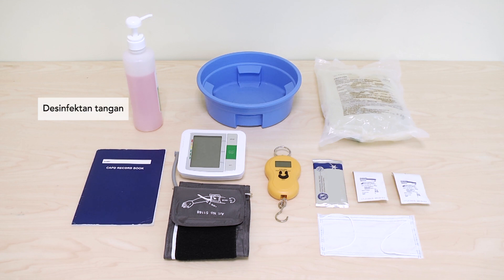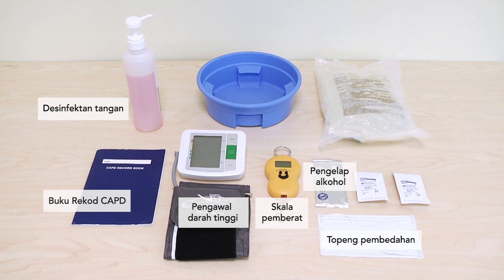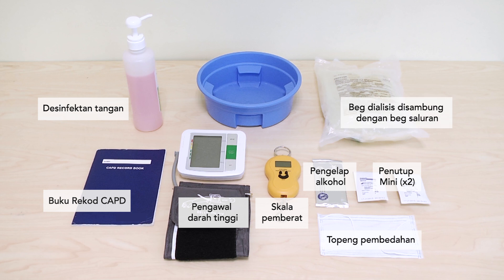Hand disinfectant. C.A.P.D. record book. Blood pressure monitor. Weighing scale. Surgical mask. Alcohol wipe. Two mini caps. Dialysis solution with drain bag attached. Basin.